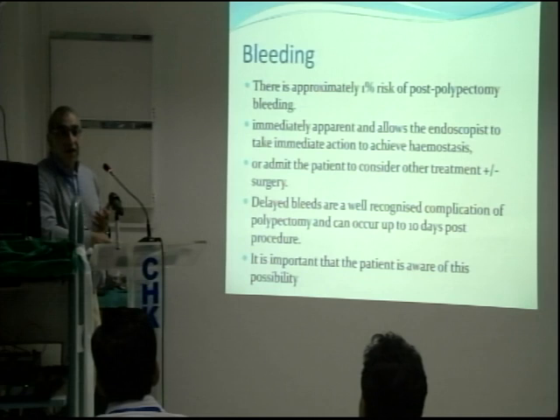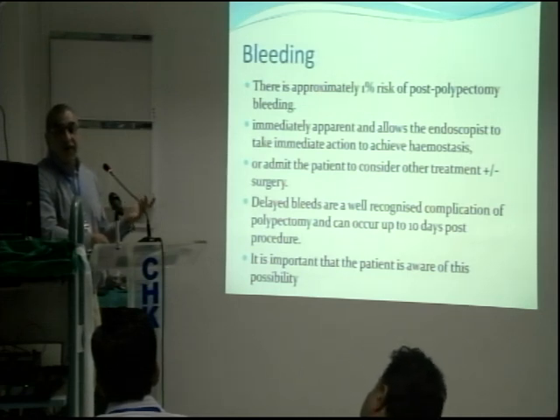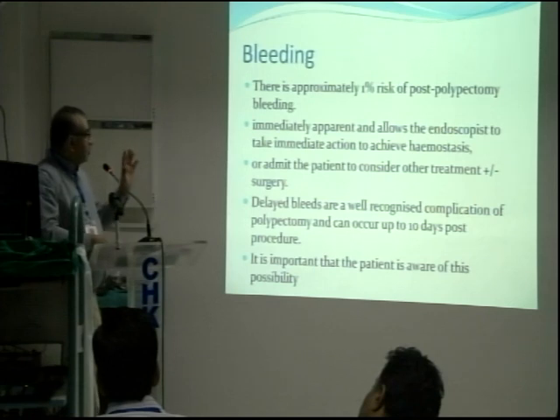I don't recall calling a surgeon to treat a bleeding after any of the polypectomies in the last 20, 25 years. So hardly ever. You can treat it there and then yourself, right?